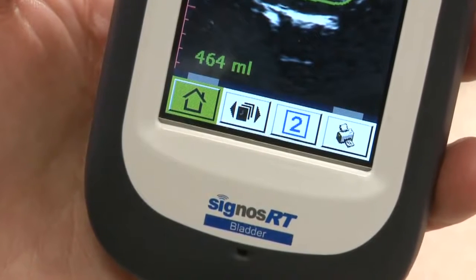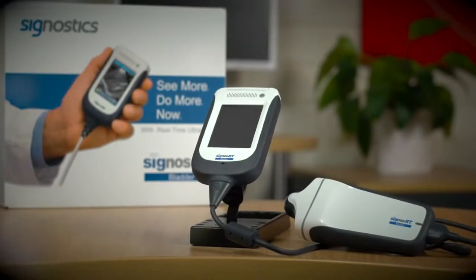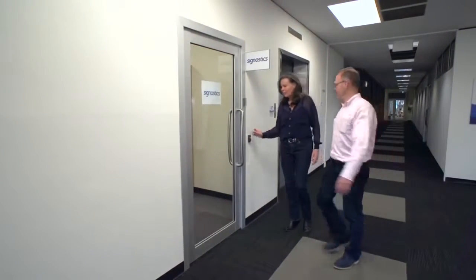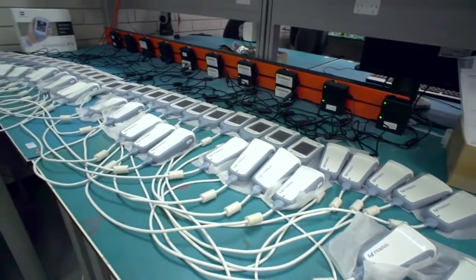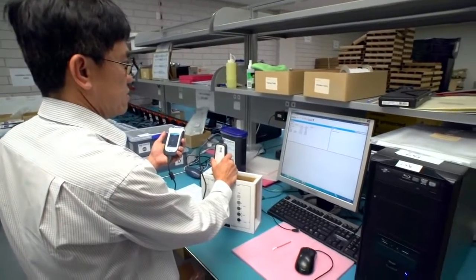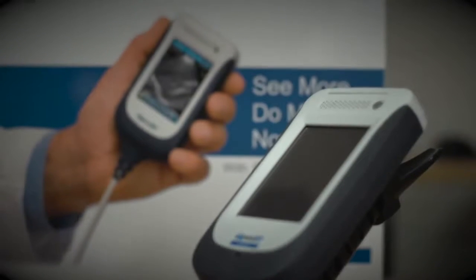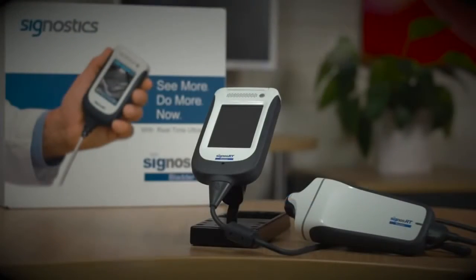Press the freeze button to begin scanning. Pressing the home icon will save and close the examination and you'll be ready to scan the next patient. The SignosRT bladder scanner is manufactured by Signostics Limited, an Australian medical technologies company with a vision to be a world leader in portable point of care devices. Founded in 2005 in Adelaide, Australia, Signostics comprises a highly motivated engineering and commercial team that is proud to deliver innovative technology solutions to medical practitioners. SignosRT bladder scanner — see for yourself.